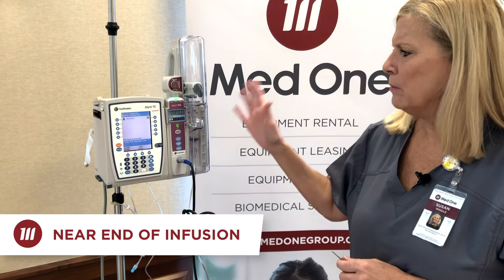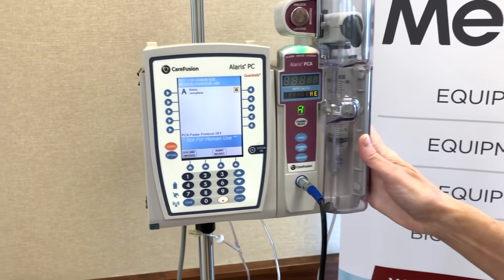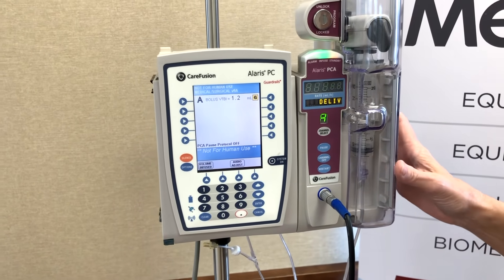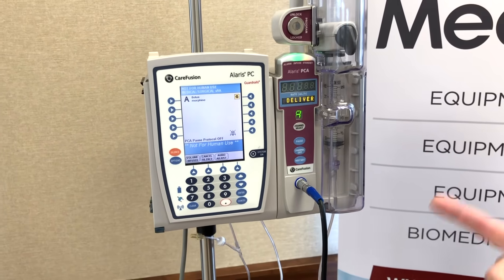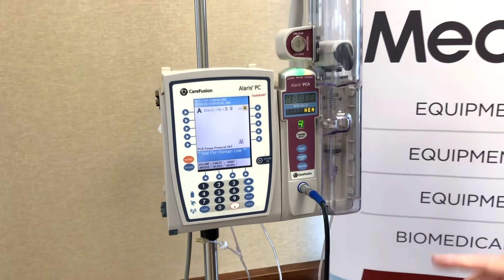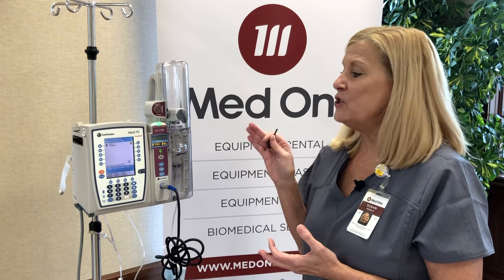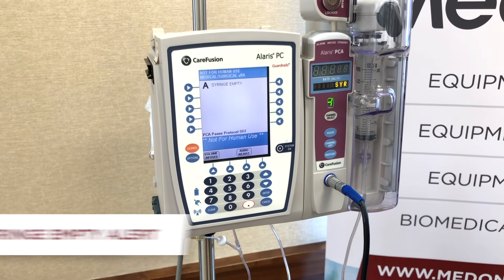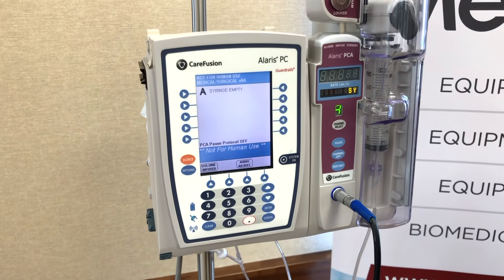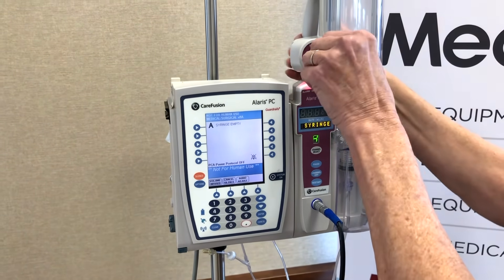During the delivery of our bolus, we received what's called a near end of infusion alert. Notice it's still green but beeping with an amber color to let you know that you need to go get your next syringe. You can press the silence button and go retrieve your syringe. This will continue like a KVO on a large volume infusion until you come back with your subsequent syringe. If you don't come back in time, the syringe will go to a syringe empty alarm — meaning it's empty and will stop infusing. I'm going to simulate that syringe empty so you can see what it looks like.